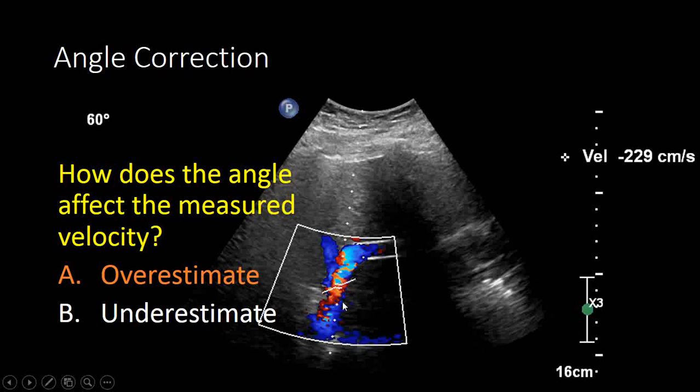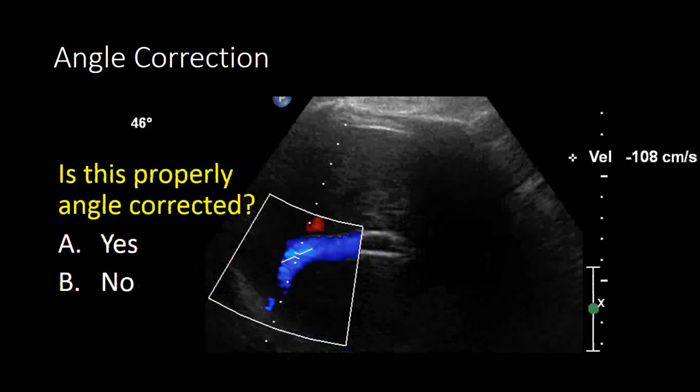So if we're not looking at this with a careful eye and doing good quality assessment or assurance of every study, we may be calling this study TIPS dysfunction, which would lead the person to having a venogram, meaning they're going to get a stick in their jugular vein, they're going to have some large bore catheters placed down into their liver, and they're going to be injected with contrast, which doesn't put the patient at great risk, but certainly increases their risks of complication and would have been an unnecessary study.